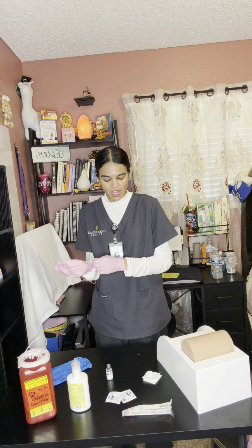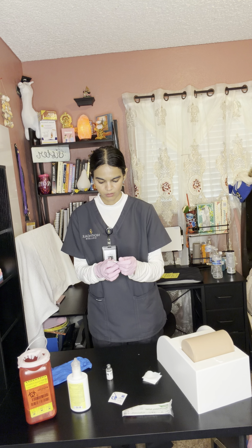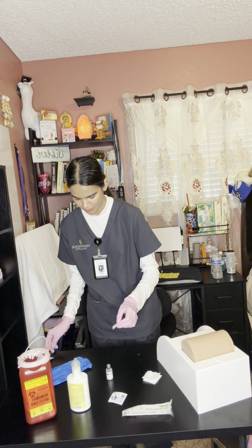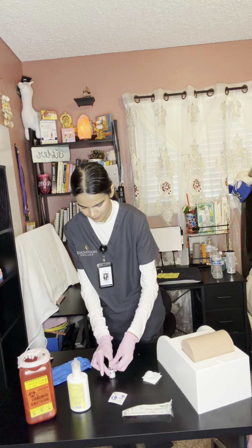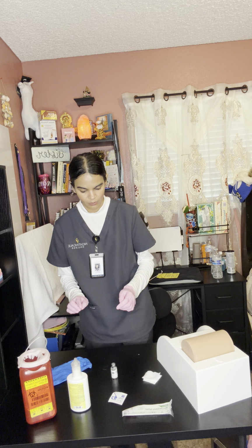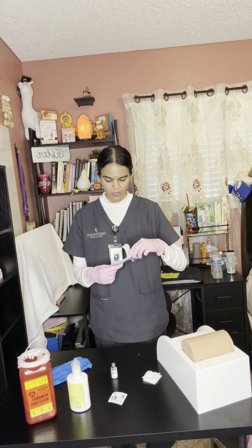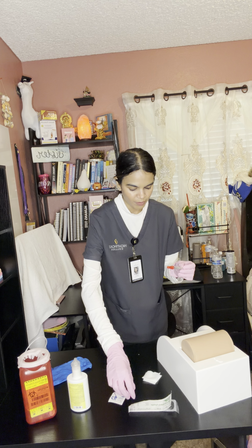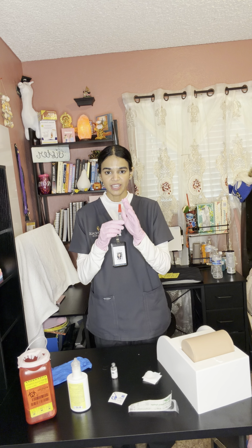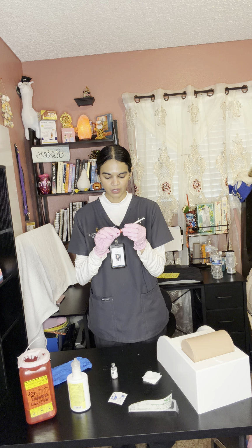Once I have my gloves on, I'll take an alcohol swab and prep the top of the tuberculin vial. While we wait for the top to dry, we can prep the tuberculin syringe. Again, this is a 25 gauge syringe with a 5/8 needle. We'll take the syringe out of the packaging. We will have the cap on and set the syringe to 0.1 ml. Then we'll remove the cap of the syringe.